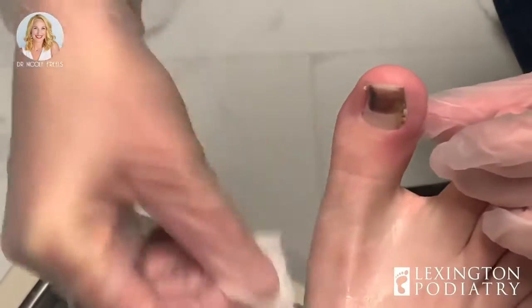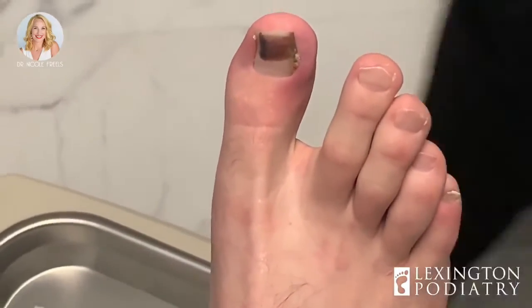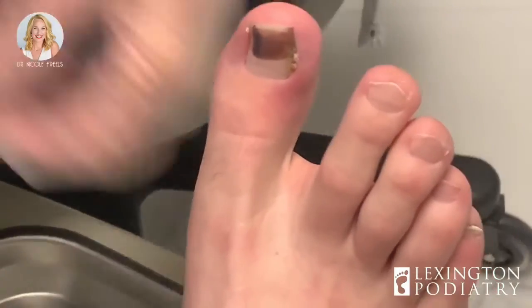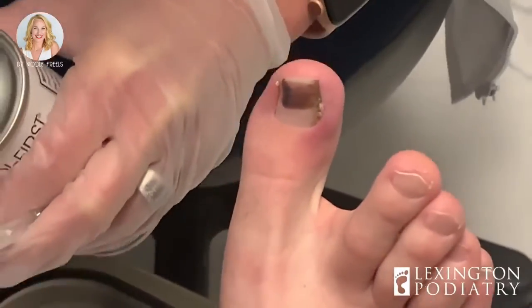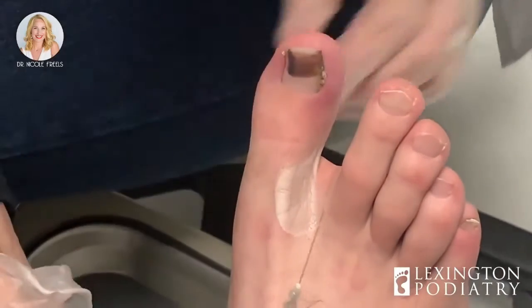Okay, so this is the fun stuff. Cold spray, then a little bee sting. Right. You just went through this, so. And you said the procedure went well. Yeah, it wasn't bad. This was the worst part, I think. Yeah, it is the worst part. Okay, so. Quick little stick.